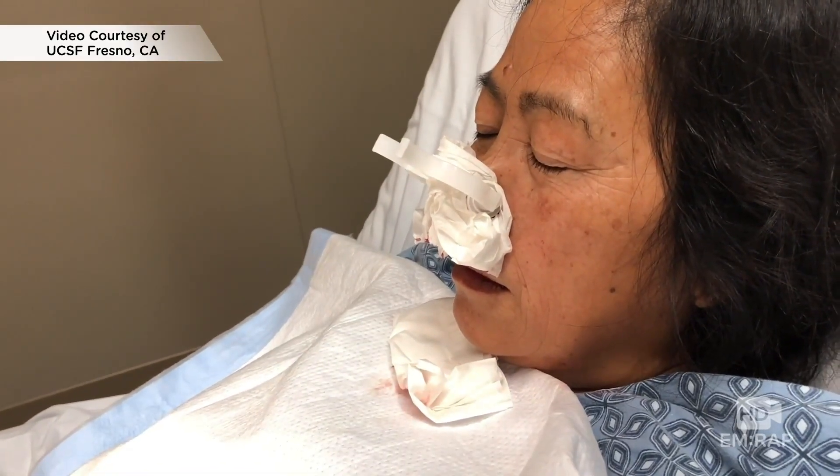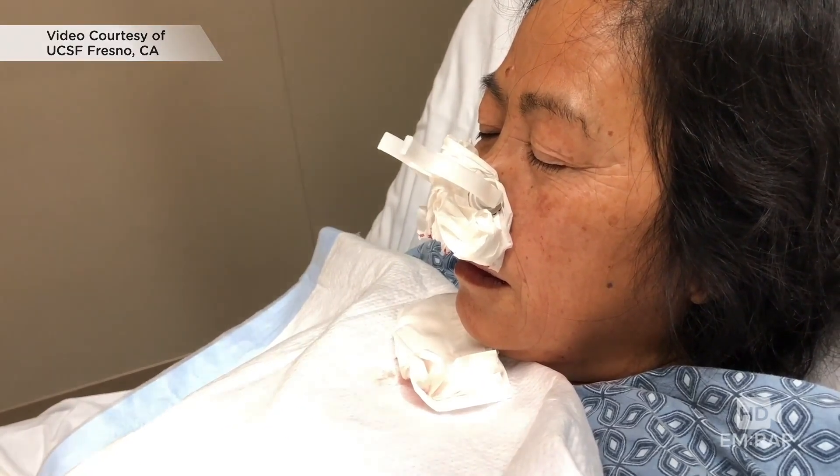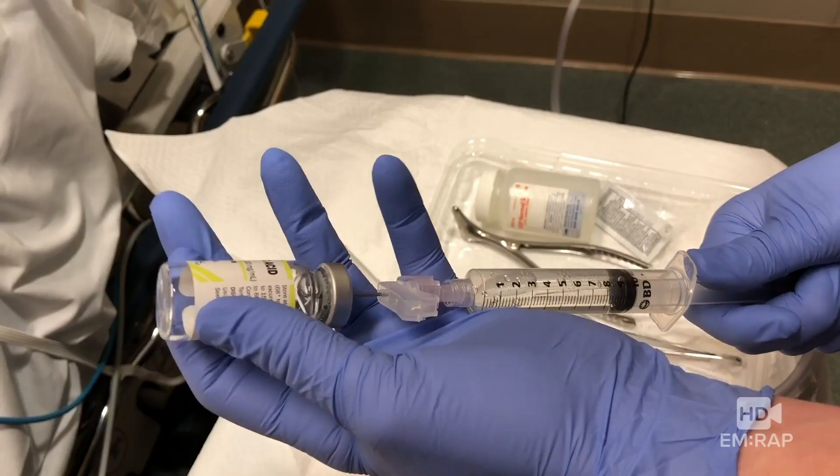This patient has epistaxis that unfortunately didn't stop with compression and oxymetazoline, so we're going to step it up a notch and try some TXA. We're using 10 milliliters of this 1000 per 10 ml solution.